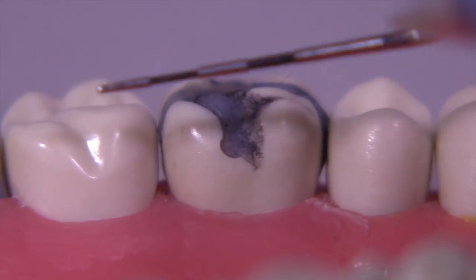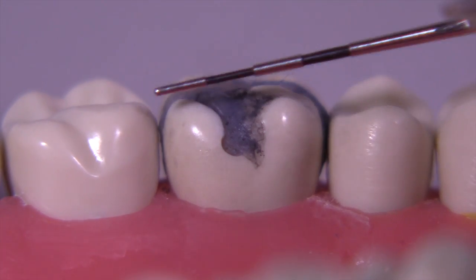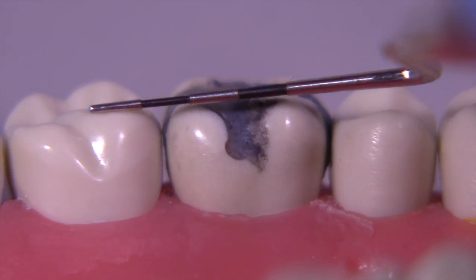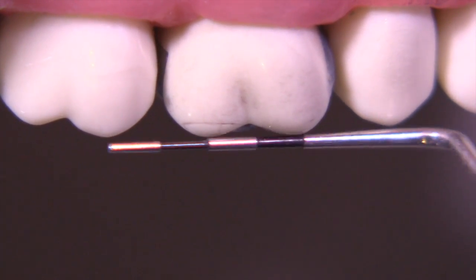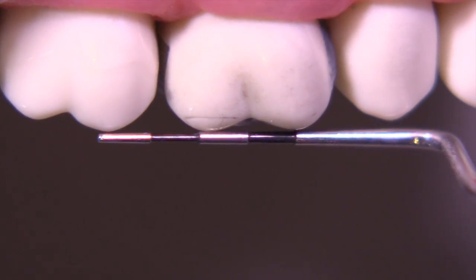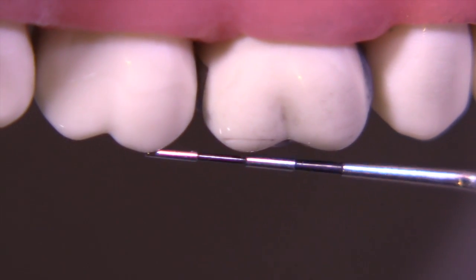We can make some assessments about the lingual side as well. It looks like we're probably going to be removing the distal lingual cusp, so we want to know where to build it up to. Looking at adjacent teeth and making determinations on cusp height, you can figure that out - look at how these cusps all line up in a row: the mesial facial, distal facial of the first molar, and the mesial facial of the second molar. Viewing from the side gives you a good idea of where to line up your cusps.